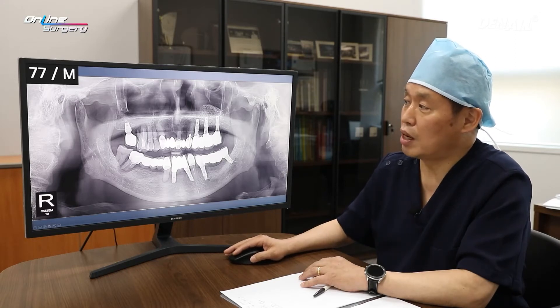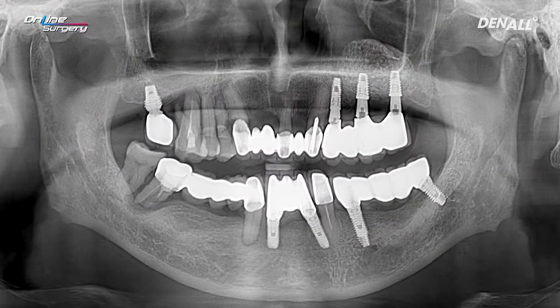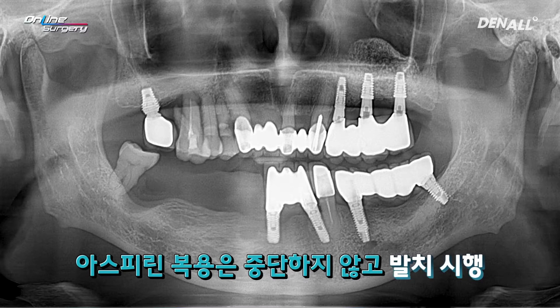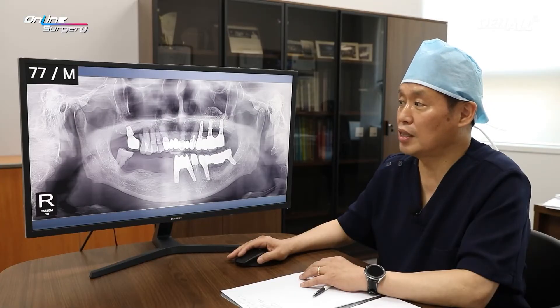The chief complaint was this area, and extraction was done. In the upper right quadrant, you can see that the condition is very bad. Around the lower anterior implant, there is a lot of periodontal loss and it needs to be removed later. I did extraction in the lower right quadrant first, which was the patient's chief complaint. As mentioned, the patient was taking aspirin as a thrombolytic agent, but continued to take the pills, and extraction was done.